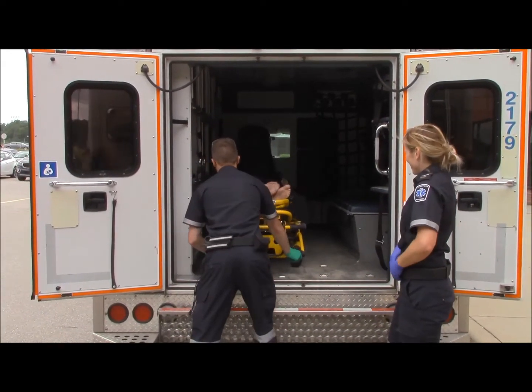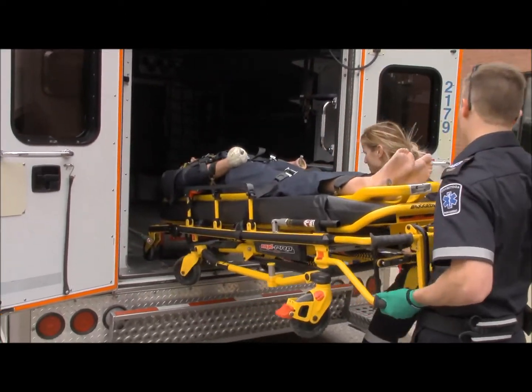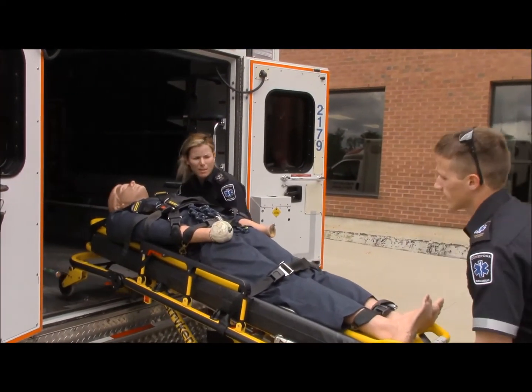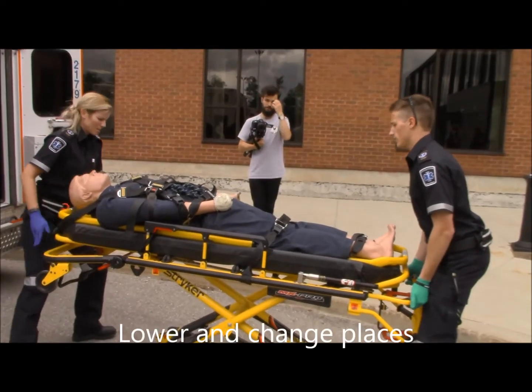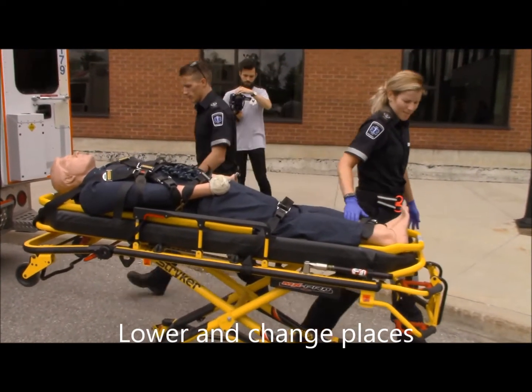Important step here is that you have your hand on the carriage as the stretcher is coming out. That way it does not fall to the ground. And you're going to lower down a couple of notches to prepare for the next round. You'll change places, and you'll complete this whole step over again.